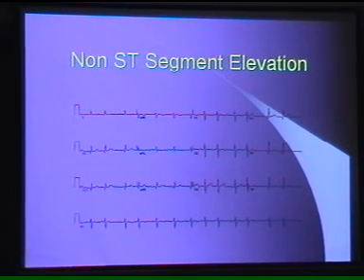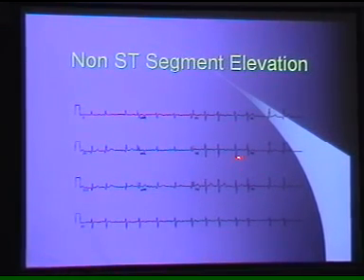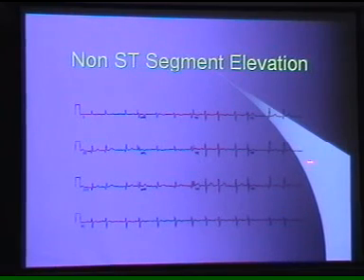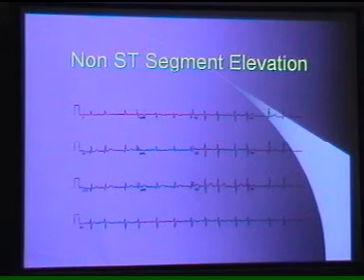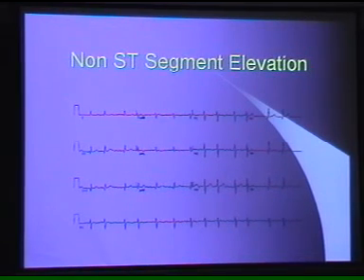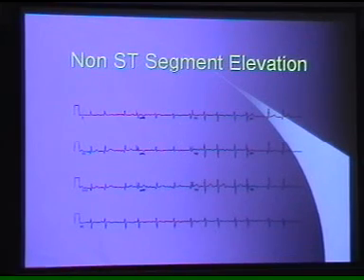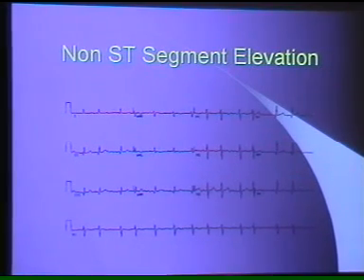So when we find that instead of ST segment elevations, there are only T wave inversions or ST segment depression but no Q waves or ST segment elevation, this is a type of patient with infarction where thrombolysis is not indicated. So not only does it help in the diagnosis, it also helps in the type of treatment you would like to give to the person. Next one.